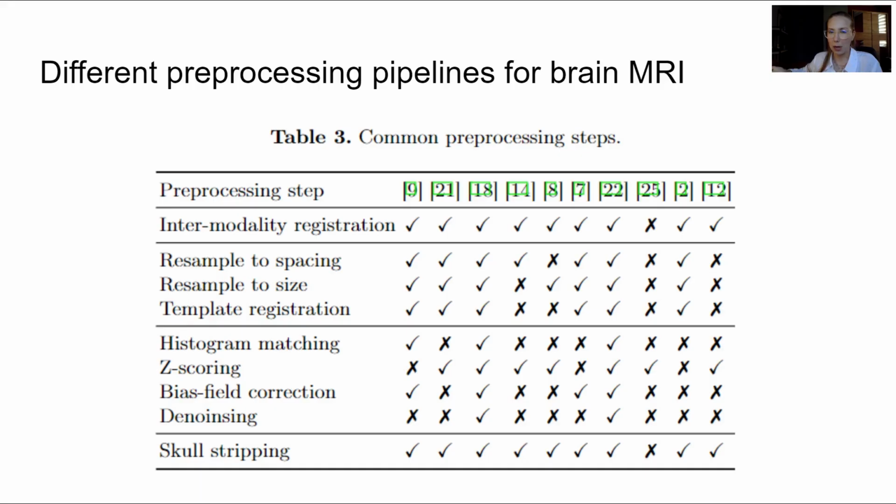So to treat brain MRI, you should know that there are four modalities for brain tumor segmentation, and for most of the studies and examinations, you will have the multimodal input, but it will not be the same dimensionality for each image out of the multimodal input. So first you should register these modalities within one subject and align them to the label, to the segmentation mask.